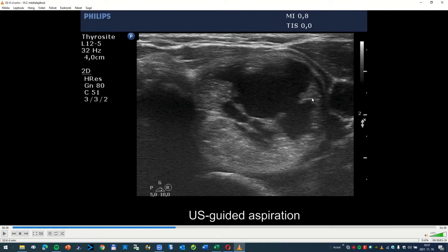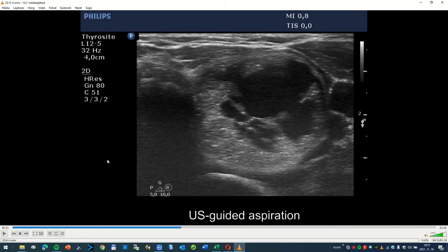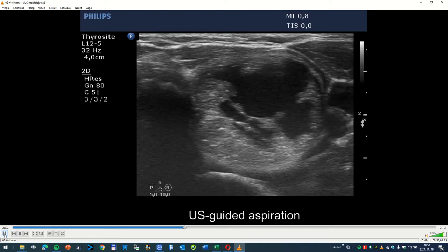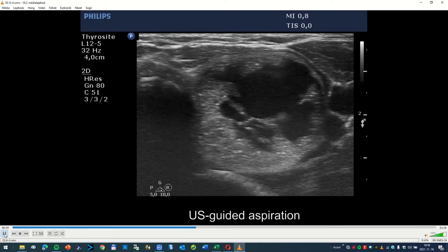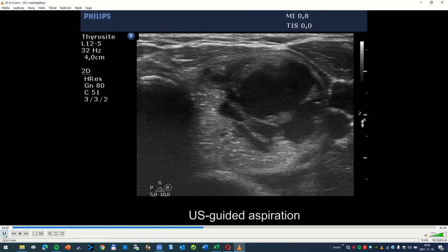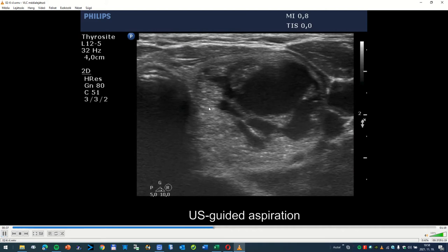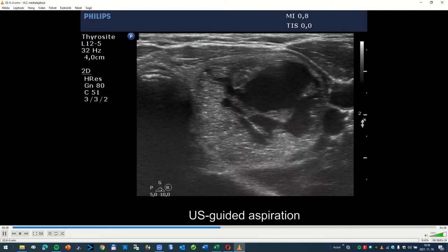Here is only a tiny cystic area ventral to this echogenic line; here is a much larger one. The issue is how to interpret these figures within the solid part. On close analysis we can see that most of these lines also have cystic areas ventral to them. Nevertheless, the entire impression is not fully reassuring. I think it is worthwhile to target this part of the nodule to gain cytological material.